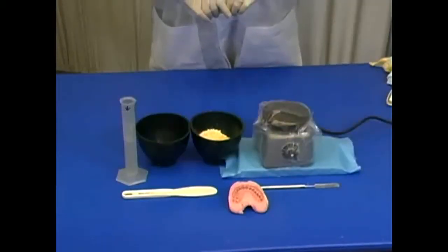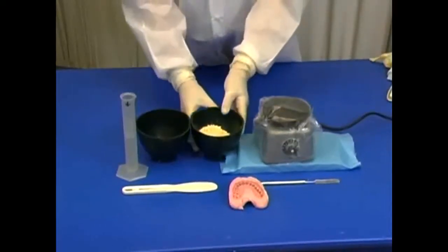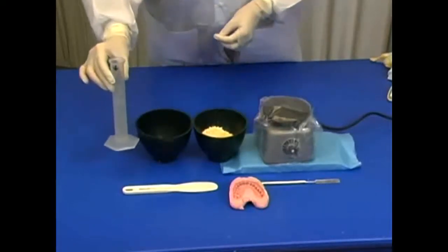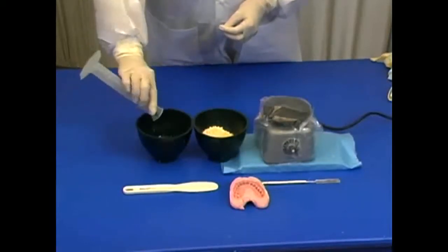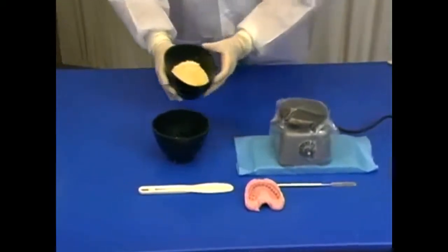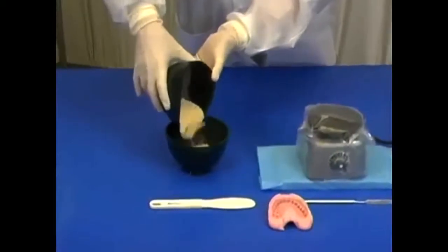The correct ratio of dental stone to water is 100 grams of stone powder to 30 to 34 milliliters of water. 34 milliliters of water is added to a rubber bowl. 100 grams of the powder is added until the particles become wet.